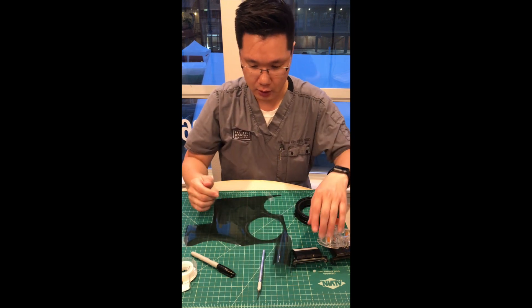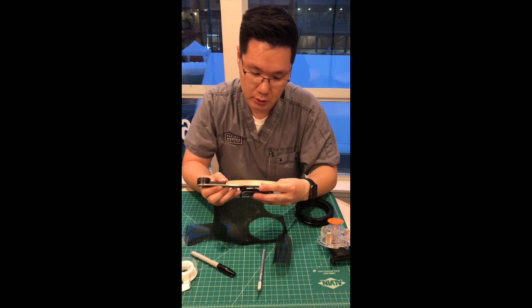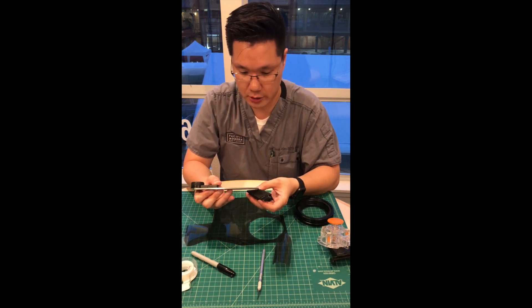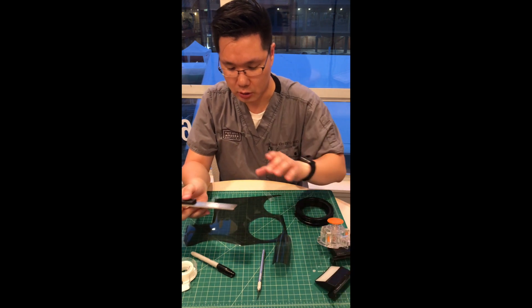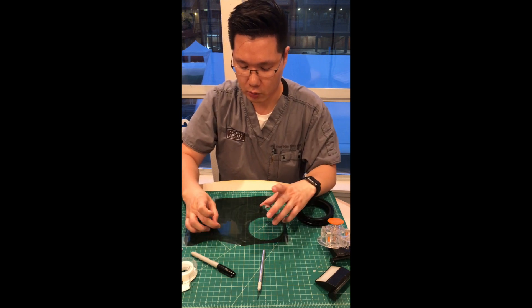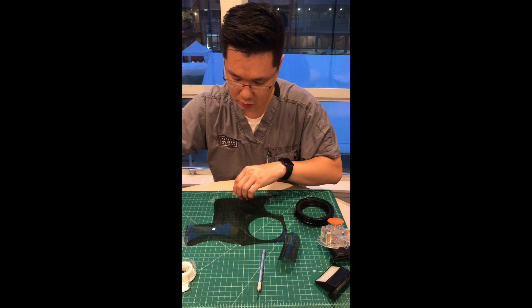Now I'm going to measure here — this is six by three centimeters — so I'm going to cut the rectangle. I want to cut it in a way so that when I align it, it's going to be at 90 degrees, so I'm going to measure from here to here.